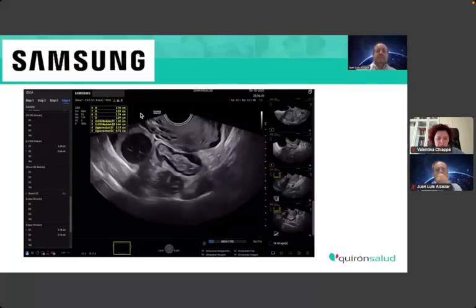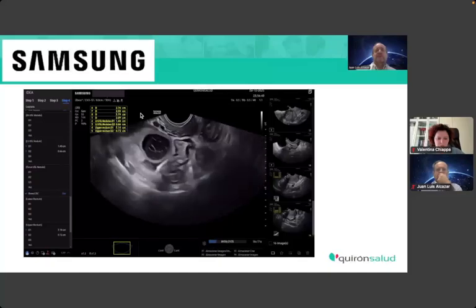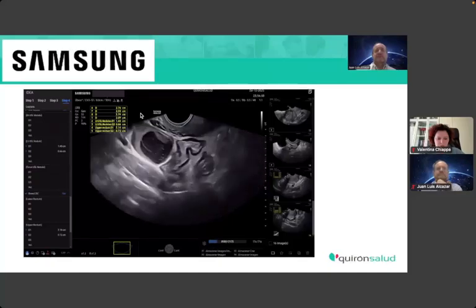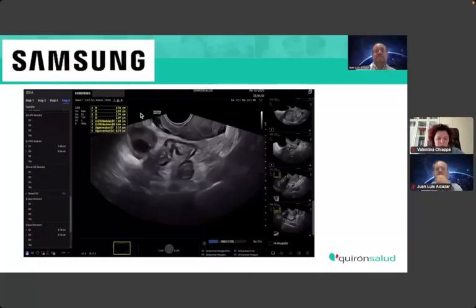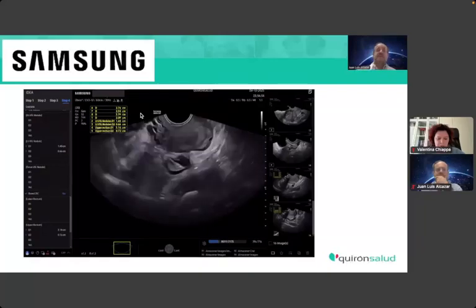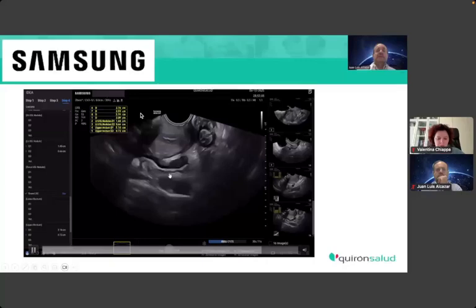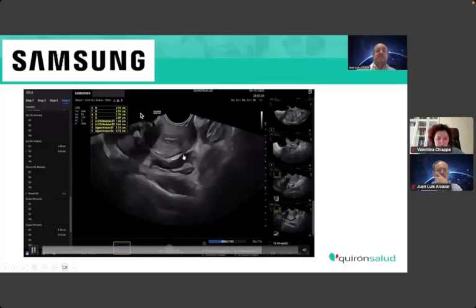And you have to look at the percentage of the circumference of the rectum involved by the nodule. So you need to take a transverse view of the rectum. And this is the lesion involving the rectum and the uterosacral ligament, the left uterosacral ligament.